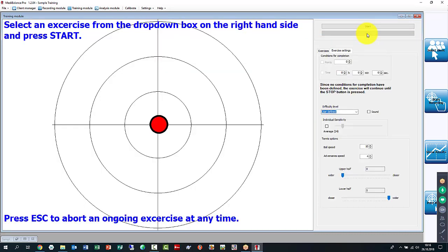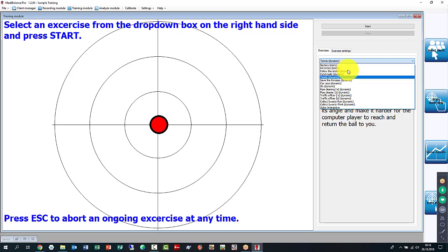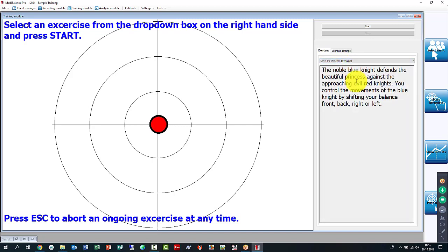So what the patient forgets about the people that train with it is, oh, they could fall, but they are so focused on the game that they come back to automating their routine of balance and shifting posture. Now, the next one, we weren't sure how it would appeal to people. We find it that particularly older people do like it quite much.